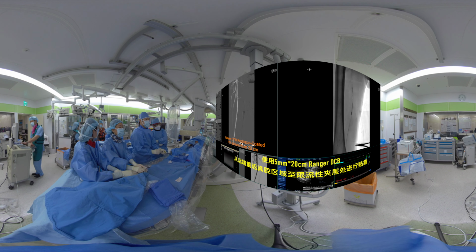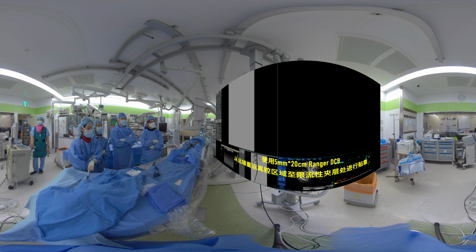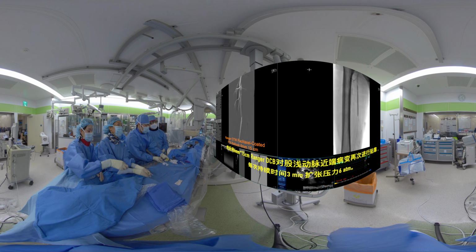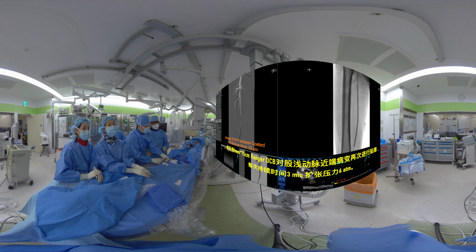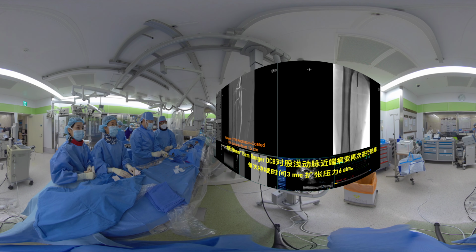A 5 millimeter, 20 centimeter Ranger drug-coated balloon was inflated from the distal re-entry site to open the flow-limiting dissection area, and then a 6 millimeter, 15 centimeter Ranger drug-coated balloon was inflated again in the proximal SFA lesions, 3 minutes at 6 ATM for each session.